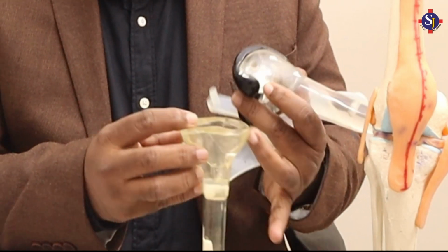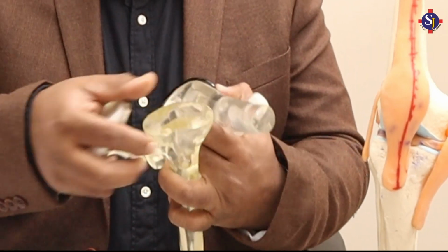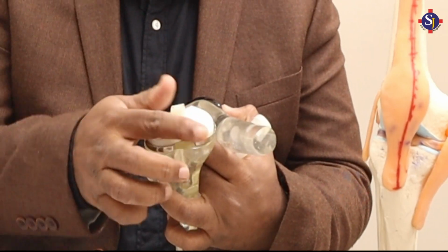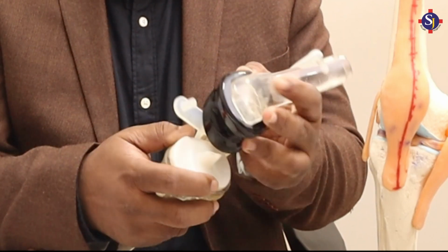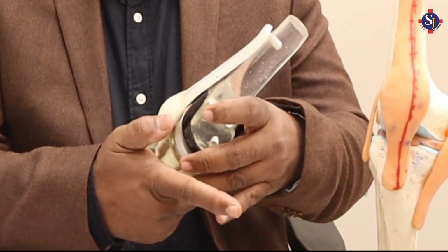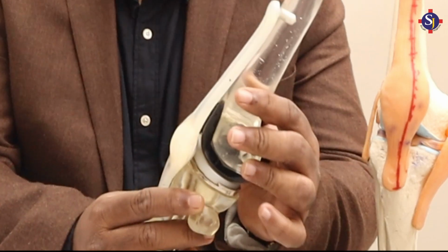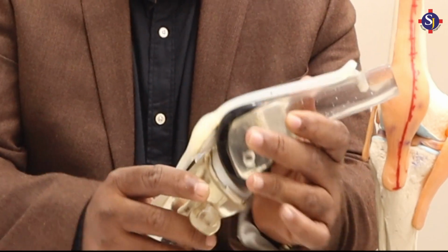Similarly, we put another cap on the lower bone with a plastic, and this articulates perfectly with the upper bone. It is designed to articulate perfectly with the upper bone, and when it does that, you get perfect movement.